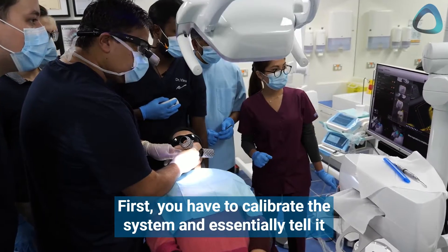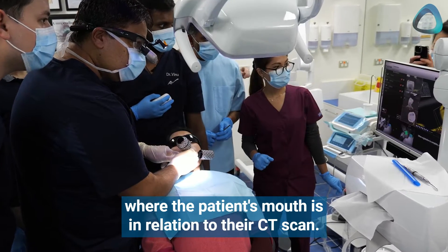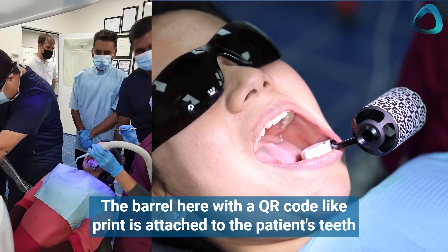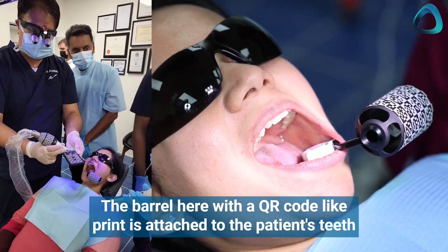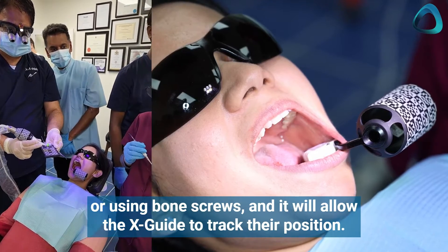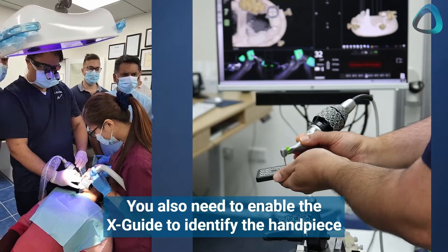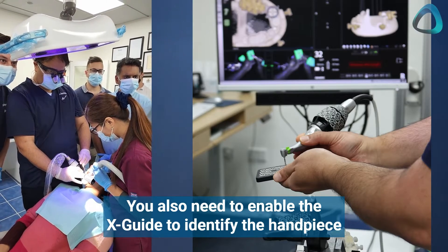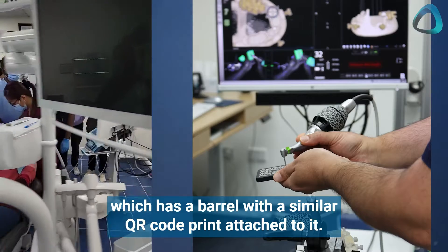First, you have to calibrate the system and essentially tell it where the patient's mouth is in relation to their CT scan. A barrel with a QR code-like print is attached to the patient's teeth or using bone screws, and it allows the XGuide to track their position. You also need to enable the XGuide to identify the handpiece, which has a barrel with a similar QR code print attached to it.